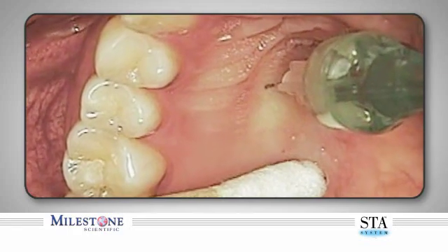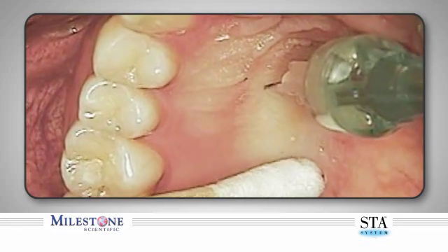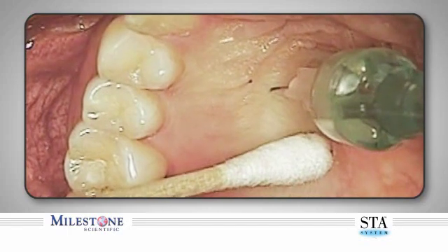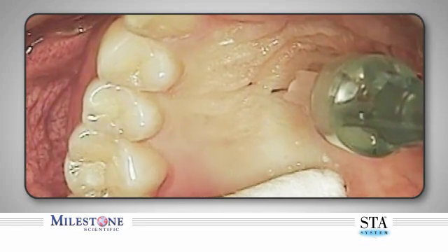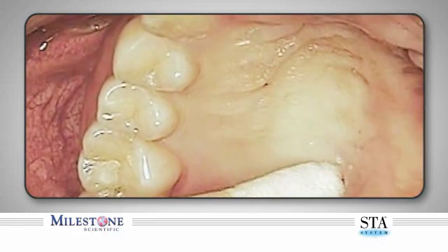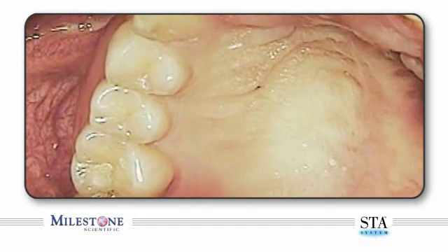As the anesthetic solution is delivered, you will notice diffused blanching of the tissue. Once the suggested volume of anesthetic solution is dispensed, the needle can be removed. Observe the needle removal technique: first, depress and release the foot control pedal, count three beeps after releasing the foot control, and then remove the needle from your patient's mouth. Note the total lack of anesthetic spray back upon needle removal. The needle is immediately directed away from the patient as a small amount of anesthetic solution may still be present. Distinct blanching will be noted throughout the palatal tissue on the side of the injection.